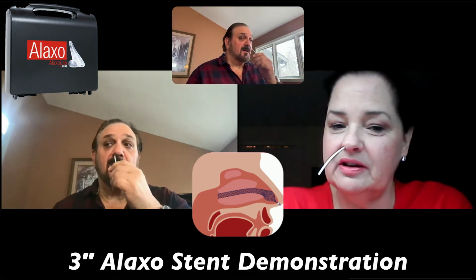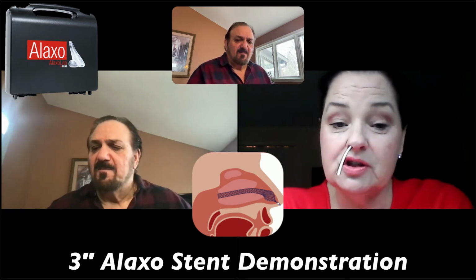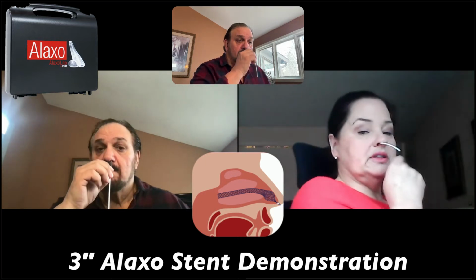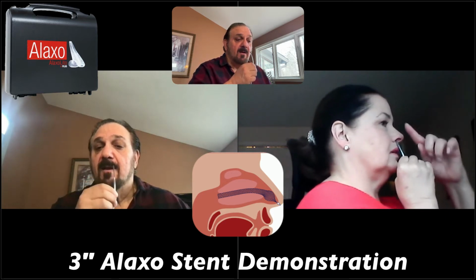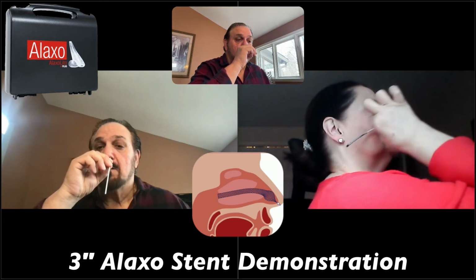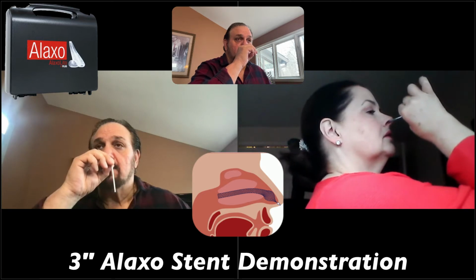Okay, so yeah, you're getting in a little bit. It seems... Did you want to try the other nostril, maybe? Yeah, maybe let's try that. So again, you're starting down here like this. See, you're starting here like this. And yes. Okay. So you need to start more horizontal. If you imagine the whole thing is pointing this way. Right. Maybe that was the problem.